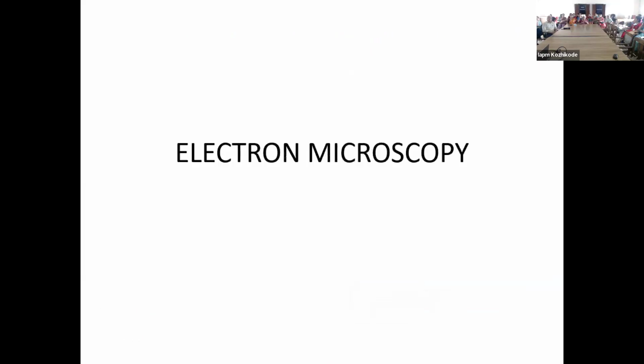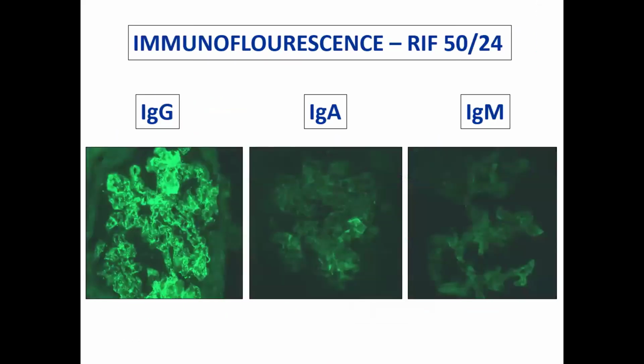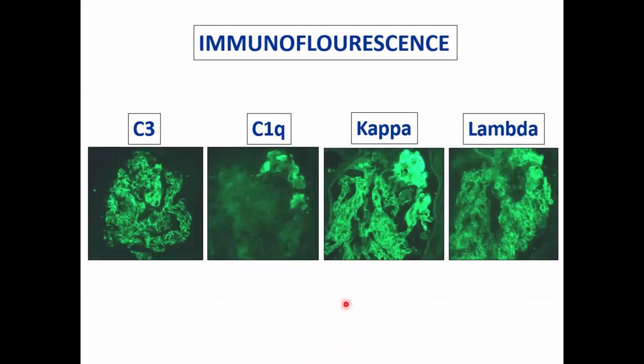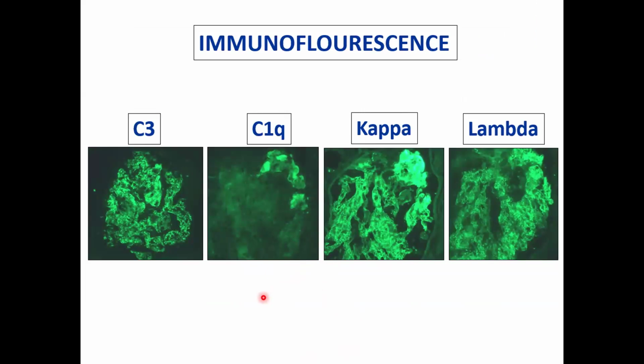I thought it is better to call it full house nephropathy and follow up the patient. Sometimes the patient may develop SLE. Only a small percentage develops SLE in such cases. Okay, ma'am. See the C1q? Not that much bright, isn't it? And patchy also. Yes, it is patchy.